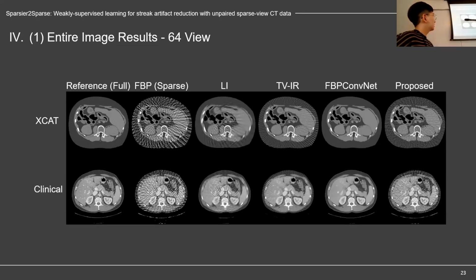I have one question. You did downsampling from 512 to 128 to 64 by a factor of 2. That integer-wise default, many people do that. For sparse view, since you are doing sparser-to-sparse, did you try sampling with other intervals, maybe 1.2, 1.3, 1.5, to see what happened?